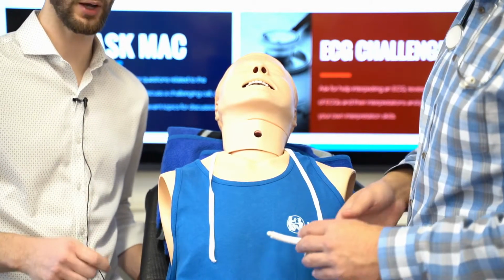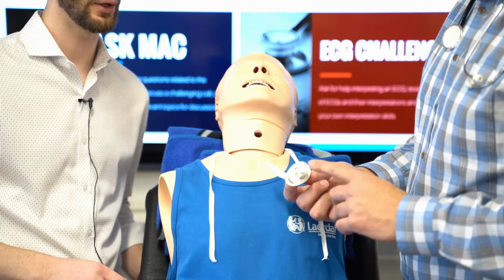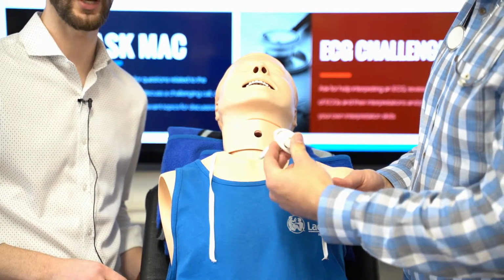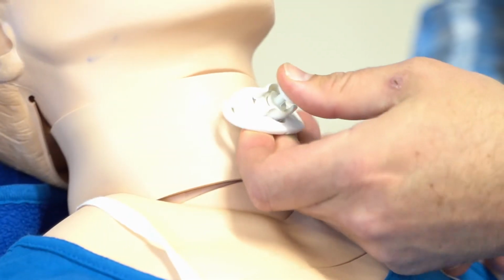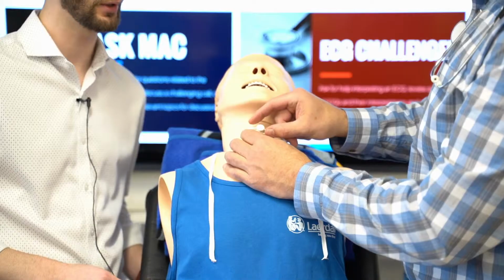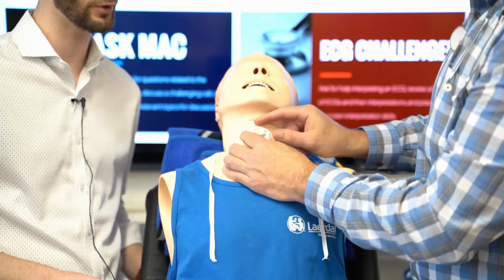Now, if possible, we want to use a brand new tube. If not, we're going to clean the one that's on scene and reuse it. Pete has our obturator already in place, and he's going to go ahead and instruct the patient on what he's doing. So we're going to go ahead with reinsertion, and there should be no hang up. You shouldn't feel any resistance. If you do, you want to take this out and restart again. Now it's very important to make sure the obturator comes out, because if it's not, it's a full airway obstruction.